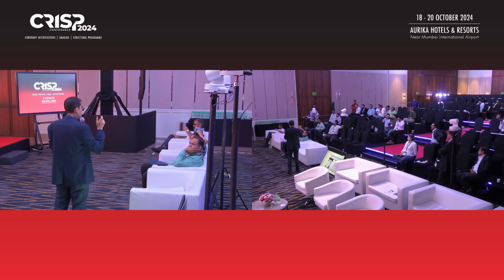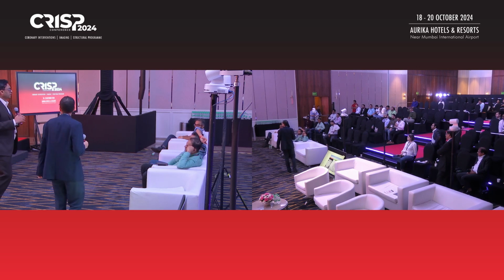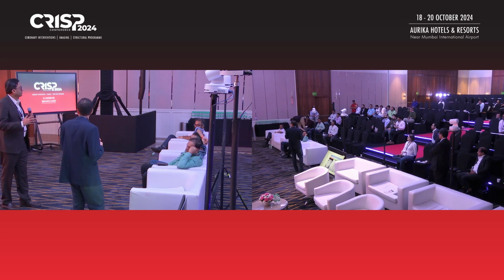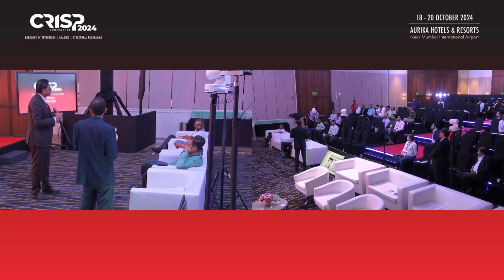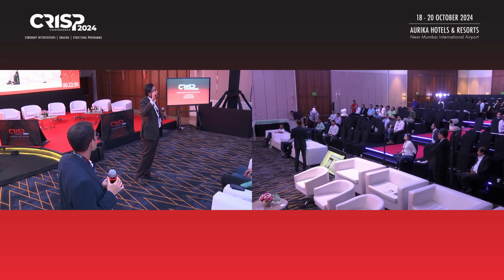So that is one clinical thing which I have come across. So my tip, because Meghav went to Liverpool, 2 years there, learned TAVI, the art, and people might not like us. We have already started practice, so it's difficult for us to go and come back. So practical tips. One thing is, when you use a ProGlide, don't use it in a TAVI first.